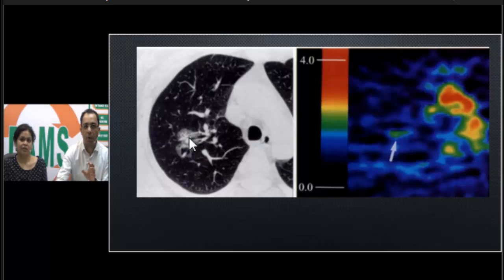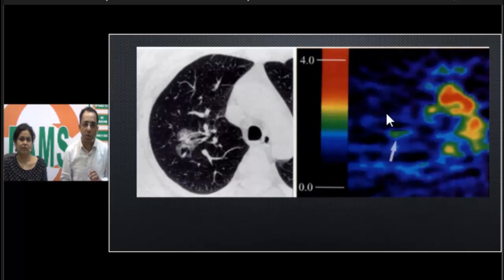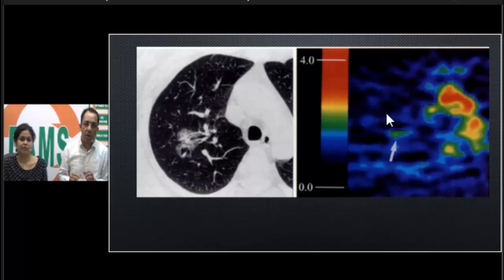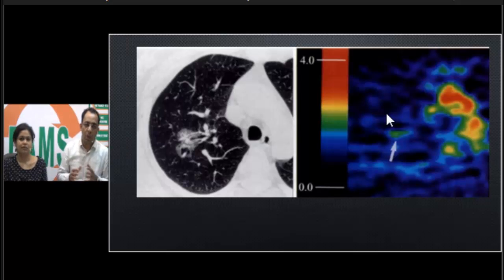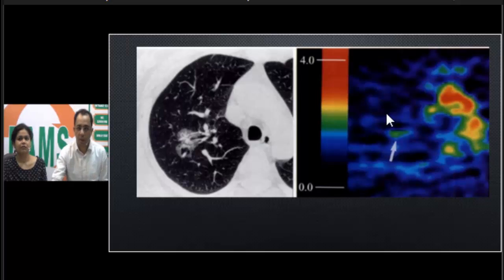Can you see the open bronchus here? When we look at the corresponding CT-PET image, what are we able to see? Low metabolic rate. This is very typical of this tumor — it has a low metabolic rate on FDG PET, and on FDG PET it is usually missed. Why? Because PET scan relies on the tumor having a high metabolic rate, while this tumor has a low metabolic rate.